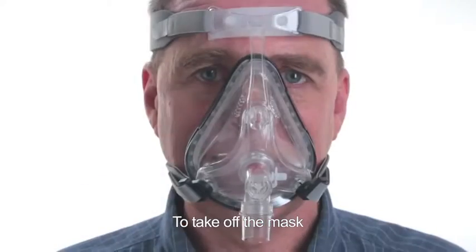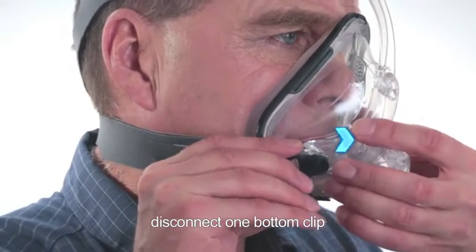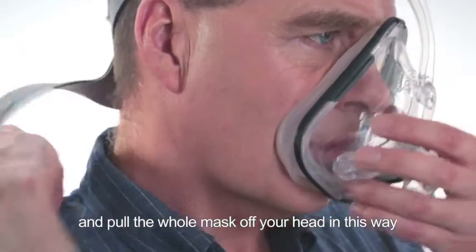To take off the mask, disconnect one bottom clip and pull the whole mask off your head.